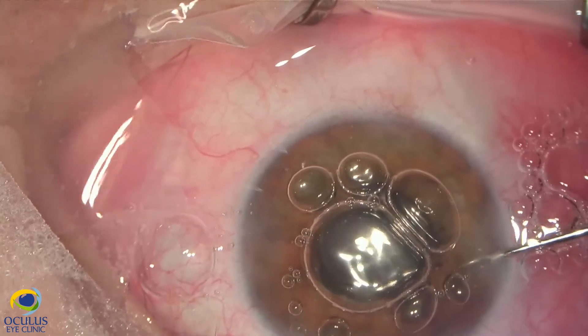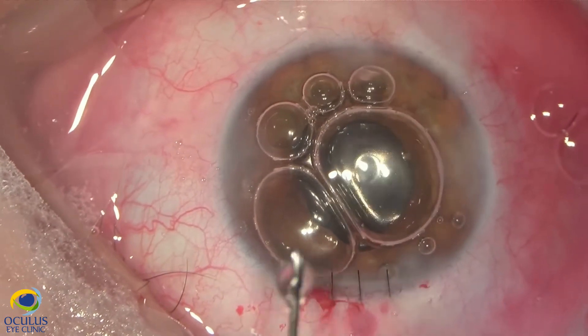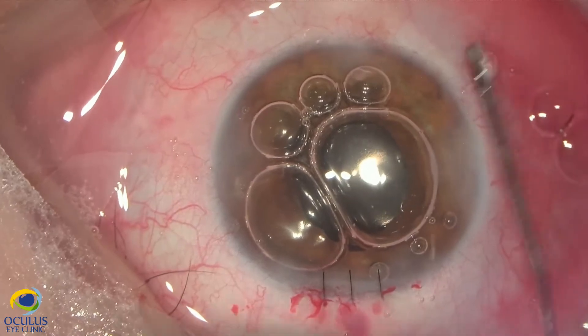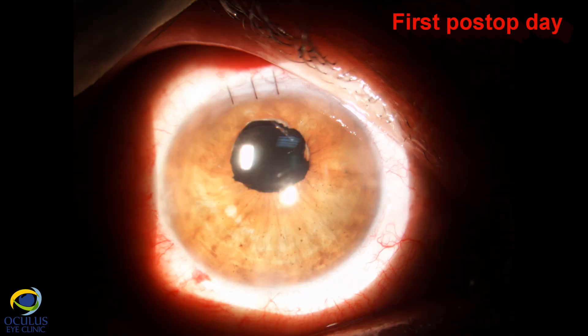We were hoping the pupil would be more round and a bit lower. My thought was that if we don't obtain the best aesthetic result, we can later place a suture on the pupil. When the pupil is under mydriatics it looks quite round, well centered, and the IOL is well centered behind the iris. Without mydriatics the pupil is a bit high, but the patient was very happy and visual acuity improved from 0.4 to 0.9.